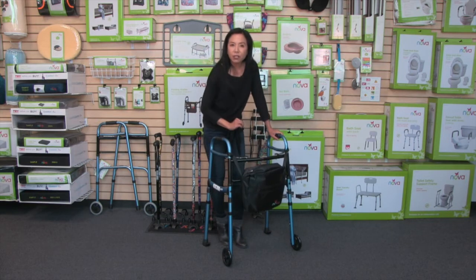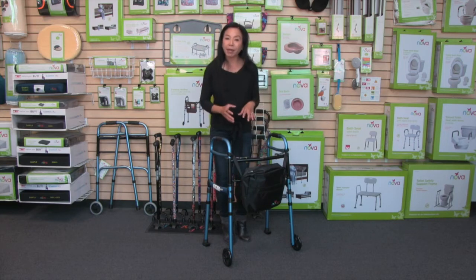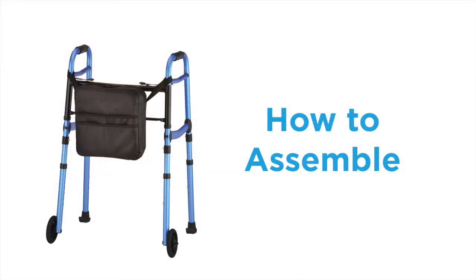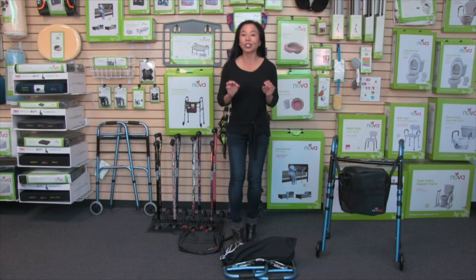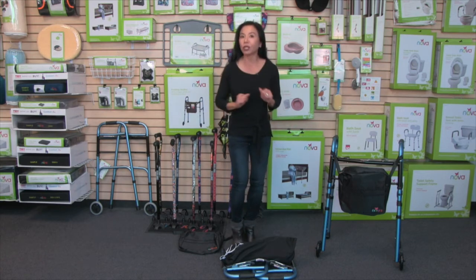Another unique feature about this walker is that it is a travel version. You can take it apart and put it back together very easily, so you can take it on trips or for storage. Now I'm going to show you how easy it is to assemble and disassemble this folding walker, making it great for storage or travel.